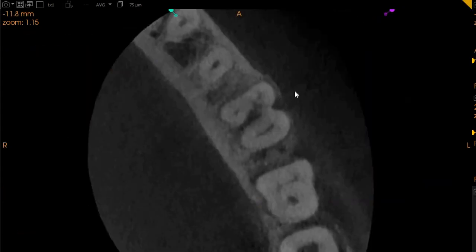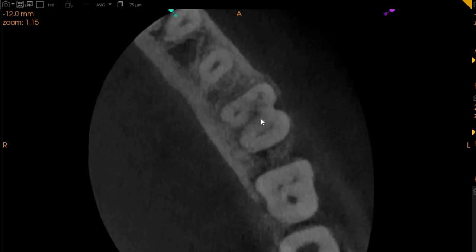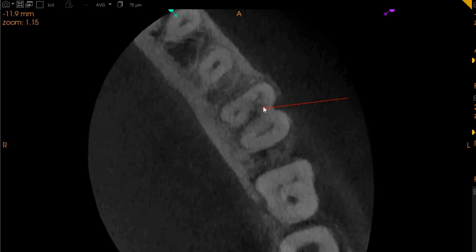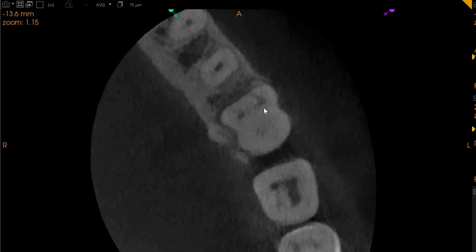Now this is the axial view, which is the top-to-bottom view. Here you can also see another crack developing. This is from the mesial buccal aspect of the mesial root and the furcation area is involved.